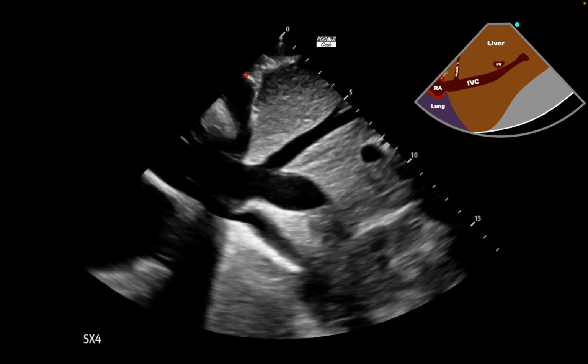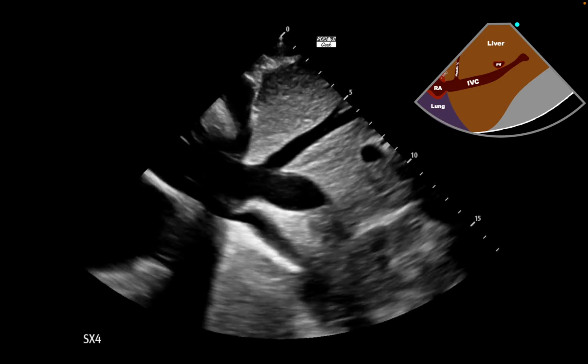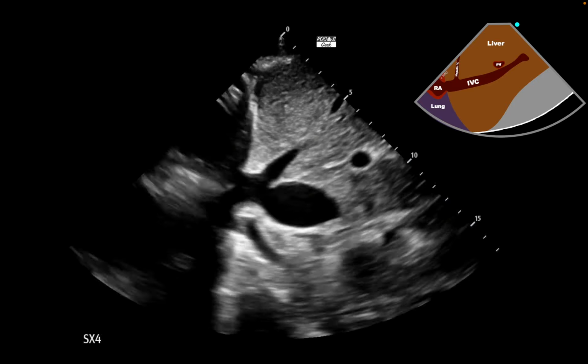Again, we can tell that this patient is having a significant amount of third spacing, and we can better see the pericardial effusion in this view. And we'll go back to the live video and we'll see the pericardial effusion, the intraperitoneal free fluid, the thoracic free fluid, and that the IVC is just not collapsing in this case. So this is important for us to understand.